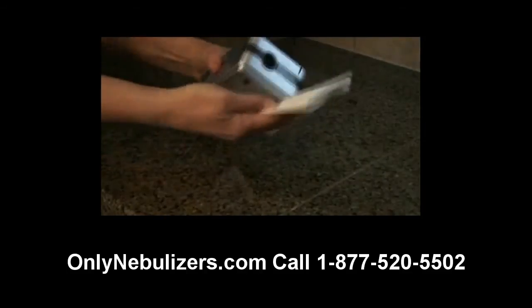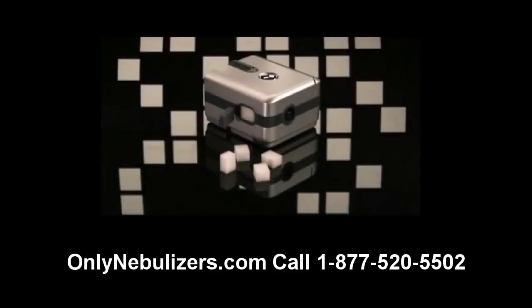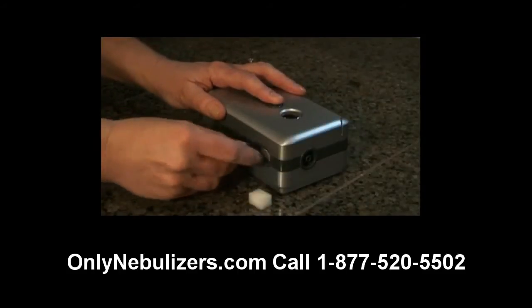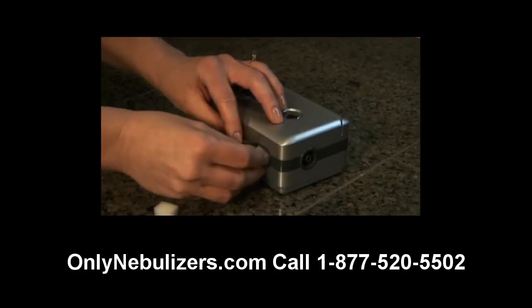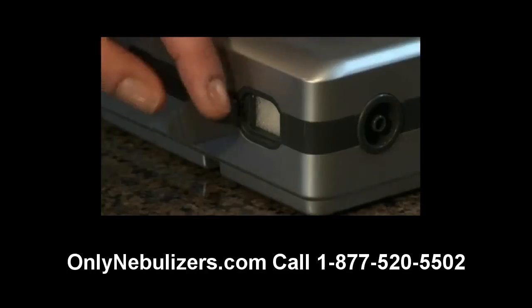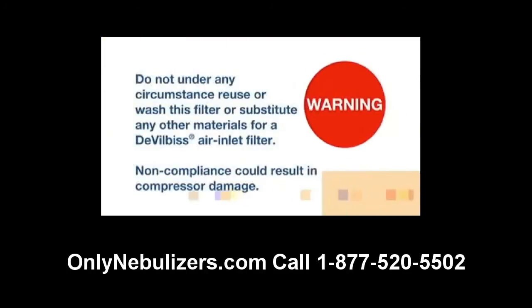Remember to clean your compressor every few days with a damp cloth to keep it dust-free. The Traveler Compressor Filter should be changed at least every 6 months, sooner if the filter is discolored. To replace the filter, simply pull back the rubber cover tab on the side of the Traveler, remove the filter, and replace with a new filter. Please note that the filter cover tab should remain attached to the Traveler and should not be entirely removed. Do not under any circumstance reuse or wash this filter or substitute any other materials for a DeVilbiss air inlet filter. Non-compliance could result in compressor damage.